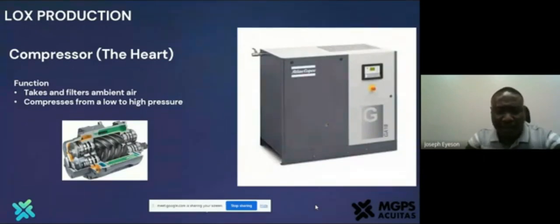And then, if there is high temperature, there is a change in temperature, there is condensation. So moisture also happens to get into the air that is being compressed. And then there's hydrocarbon because of the oil, and there is moisture, and then there's carbon dioxide. So these are the things that are carried along in the air that is being compressed. So the basic idea is to try to take out all these components from the compressed air from the PSA system. We know the principle of a compressor.